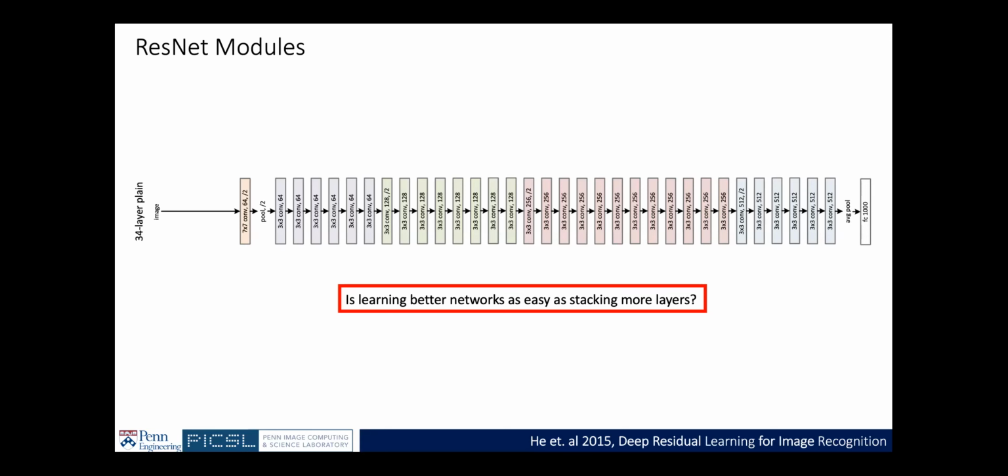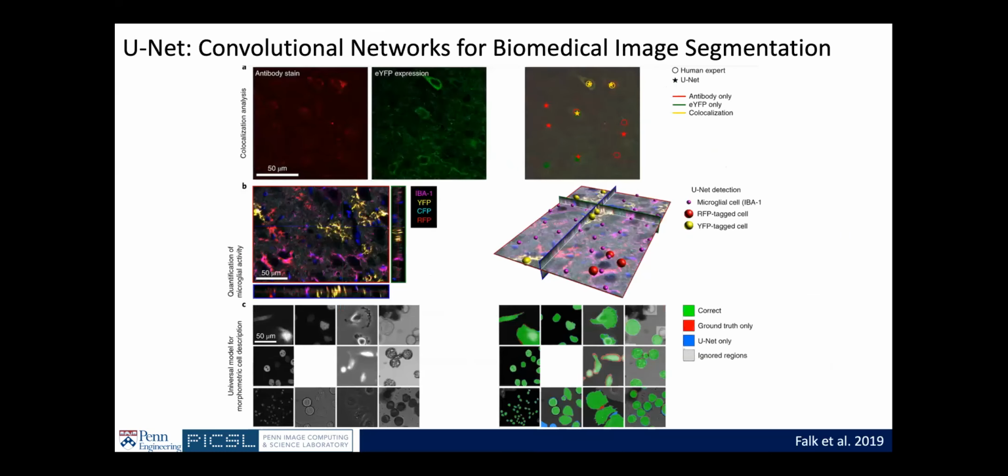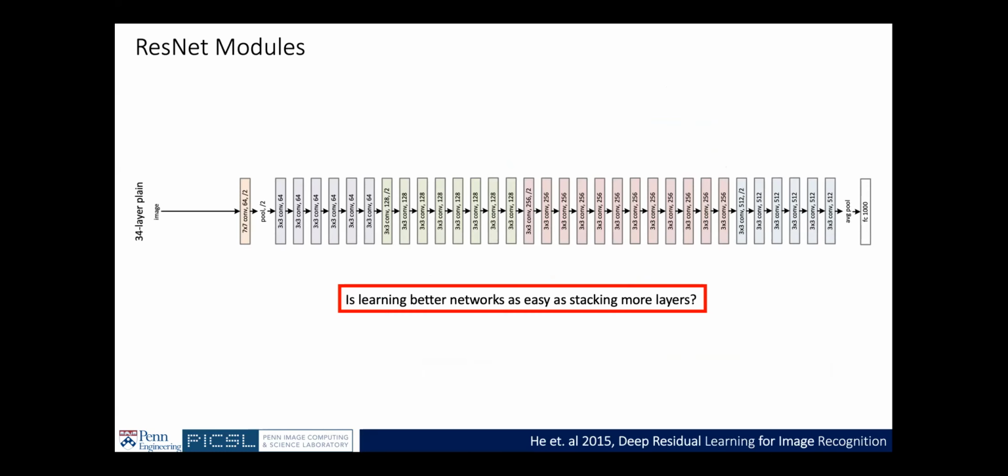So we saw in the previous slide that these skip connections were the main feature to get the performance improvement. So what next? The natural question to ask is, if we stack more convolution layers, even in that autoencoder, would that boost the accuracy of your segmentations?